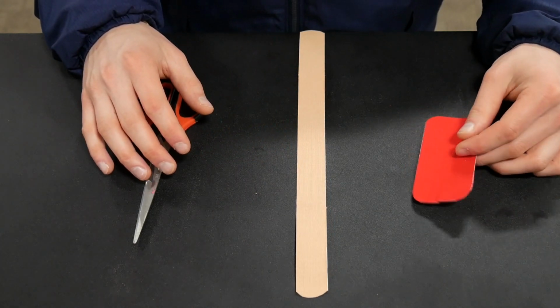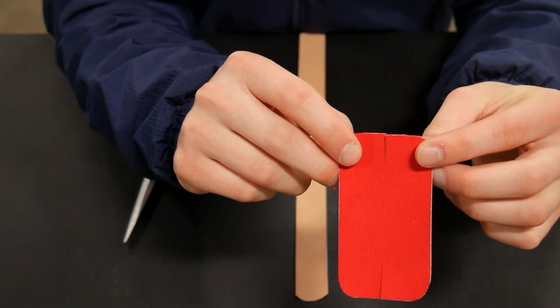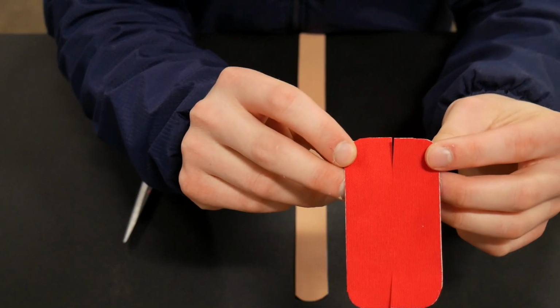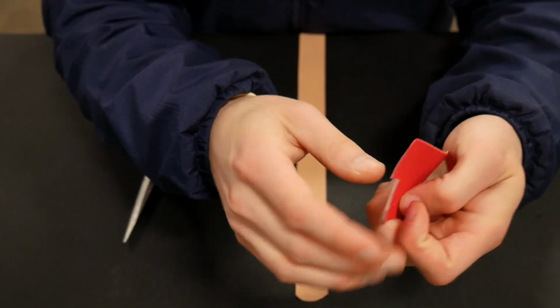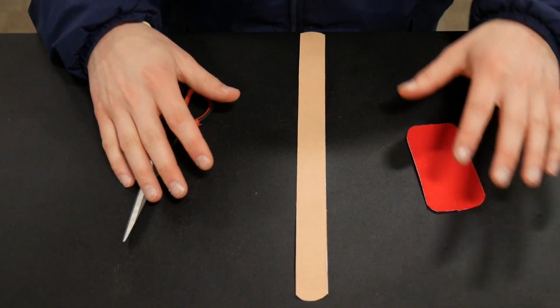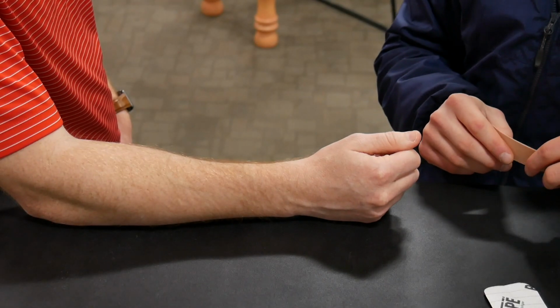And on the 2-inch piece, that's the shorter, wider piece, you're going to need to come into each end and make a snip and cut it directly in half, about 1 inch into the tape. As you can see here, I've made a little snip here and then came to the other end and made a little snip there, and we'll talk about why we need that a little bit later in the video. Okay guys, so let's get right to it.